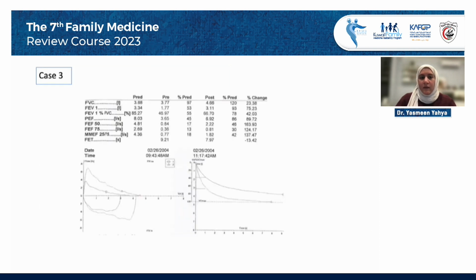This is again a case that shows the FVC is 97%, normal, but the FEV1 is 53%, and the ratio measured was, excuse me, I don't know, I lost it, but yes, it's this one, 46%, which is low.